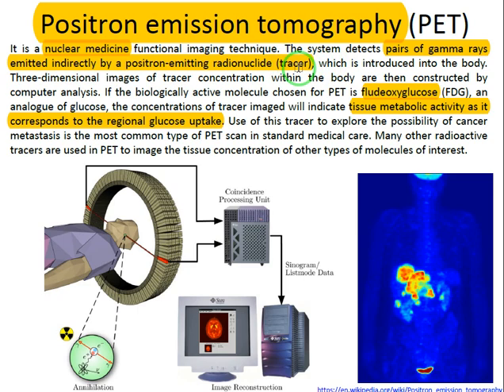If you remember, we mentioned that in the case of fluorescence microscopy, it is the fluorophores which send the signals. In the case of MRI, it is the relaxivity of the hydrogen atoms in the water contained in the body, which we get the signal from, and only the presence of the magnetic nanoparticles will increase the contrast of the MR images that we can take.